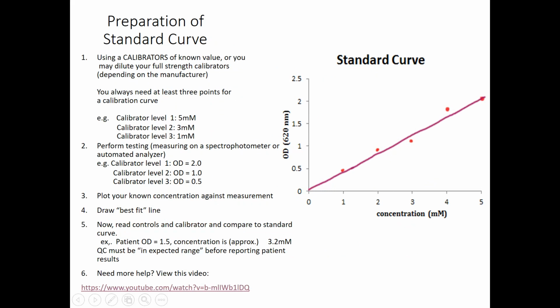What we do when we prepare a standard curve is we buy calibrators that have a known value, for whatever it is we're testing for, whatever the test methodology is. We used standard curves in my old lab as a backup confirmation method for hemoglobins, for example. You can do it for all different things, but in this case, we're looking for the concentration of either antibody or antigen. For a standard curve, you always have to have a minimum of 3 calibrators.